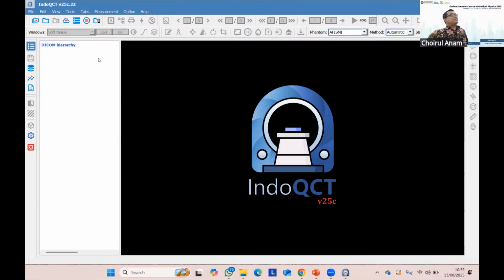Okay, in the IndoQCT, this is the first appearance of the IndoQCT. There are many tabs in the IndoQCT. This tab is for the DICOM viewer, and this tab is for measuring the image quality and for measuring the geometrical aspects of the CT image, and this one is for database management, and this one is for the image comparison and so on, and this one is for the setting of the IndoQCT.